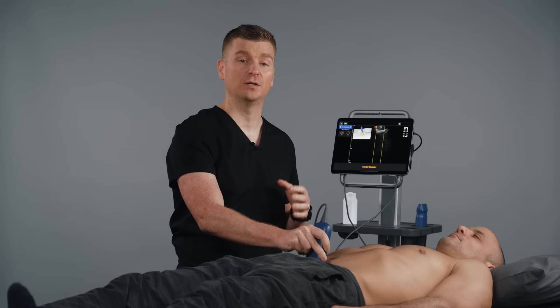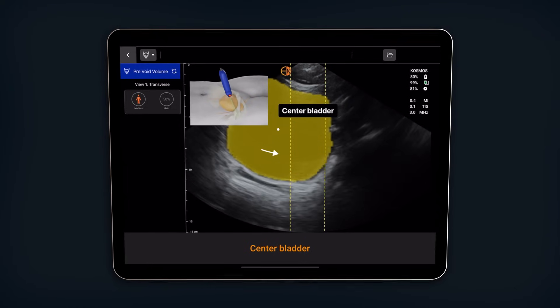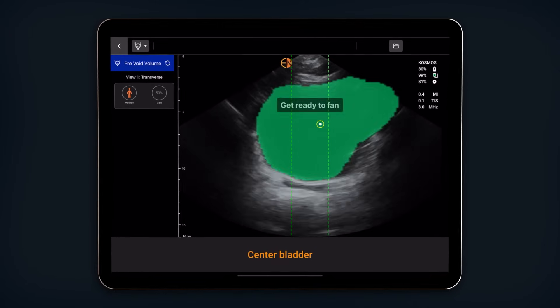Cosmos AI will identify and highlight the bladder. If the bladder is not centered on the screen, it will appear yellow, with an arrow indicating how to re-center the bladder. Once the bladder is centered, it will change from yellow to green, and you will be instructed to start fanning.